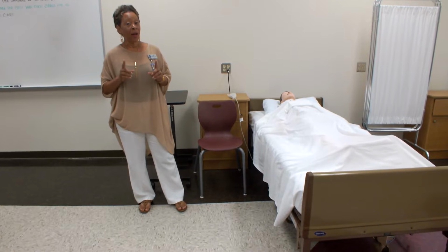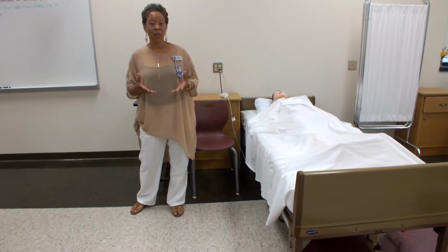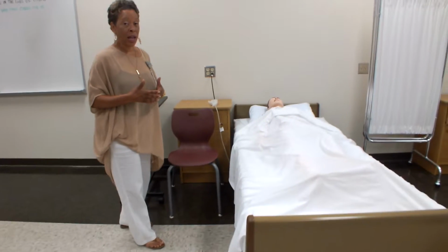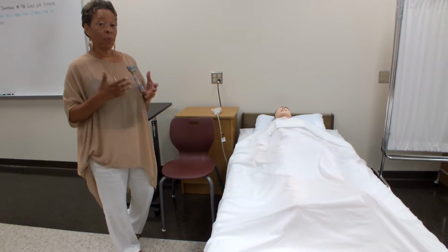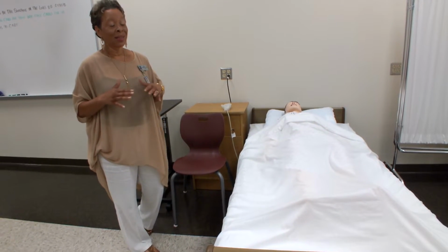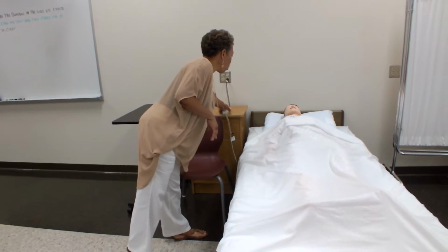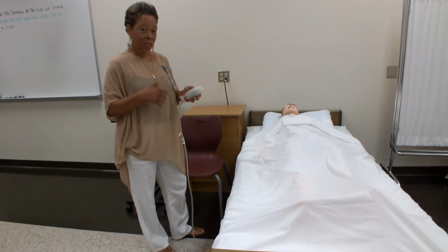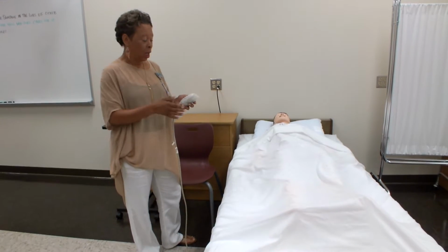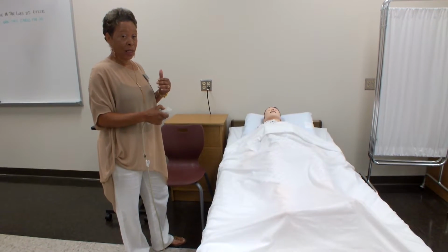So first, we're going to talk about the head of bed, okay? And particularly pertaining to the testable skill feeds client who cannot feed self. So the head of bed has to be raised to a high Fowler's position anywhere between 75 and 90 degrees. What is 75 degrees to you is not going to be 75 degrees to that NAE. So in order to lower the risk of that NAE misperceiving the angle of the bed, it's best to go ahead and raise that head of bed all the way to 90 degrees, okay?